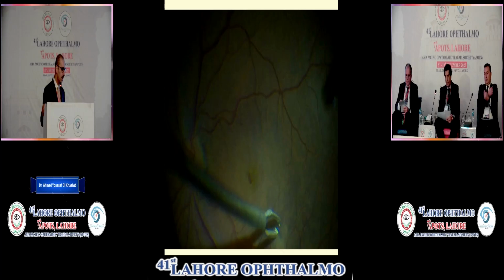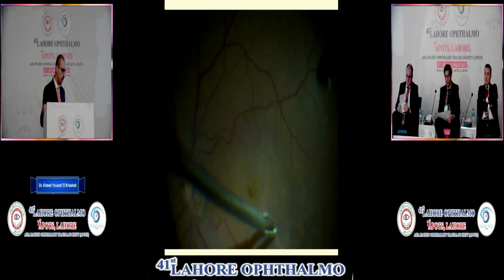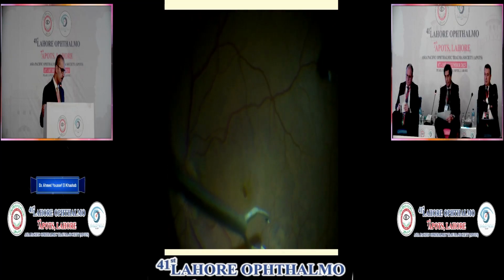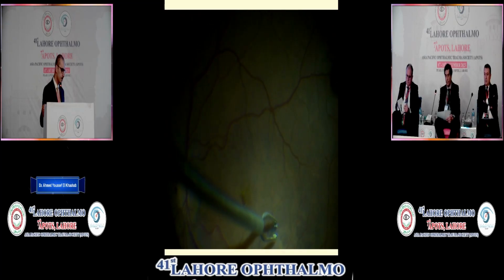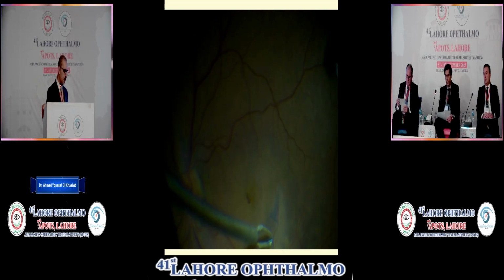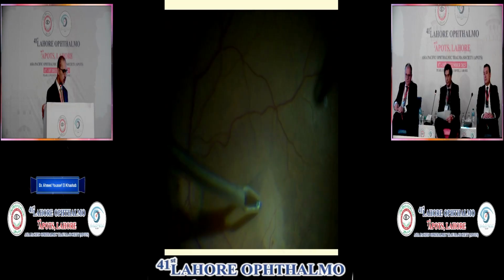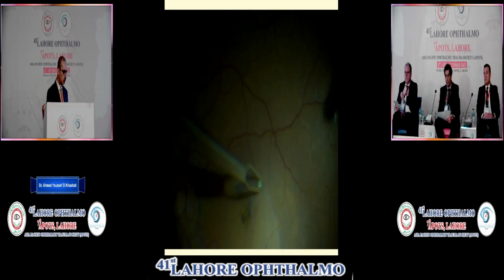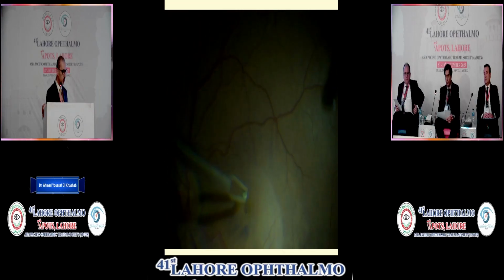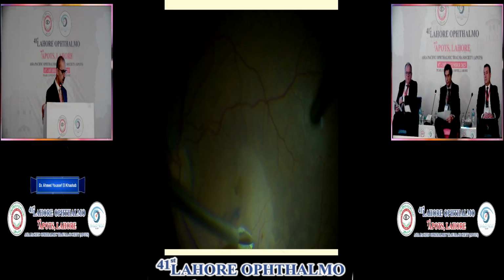So in this case, I used multiple inverted flaps, not just one flap creating the initial pinch, and multiple flaps to cover this hole, to make sure that these flaps would not be re-everted again, and to make sure that this closure would be a permanent closure of the hole.